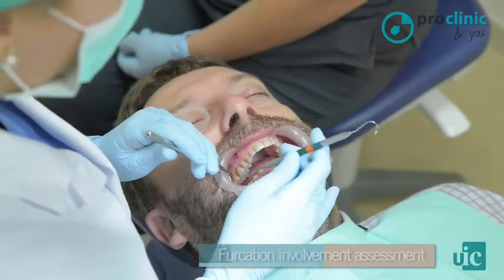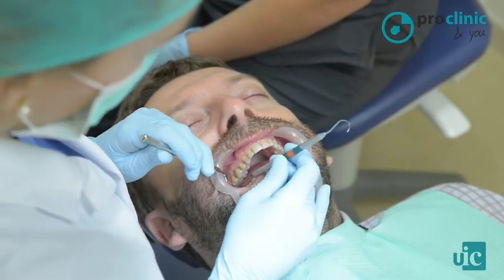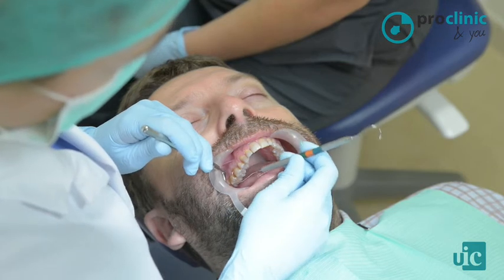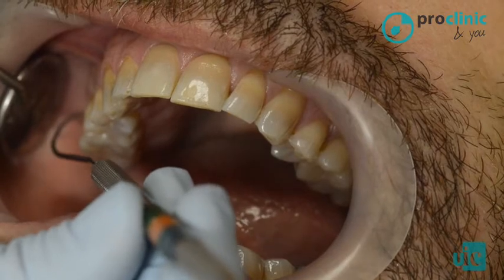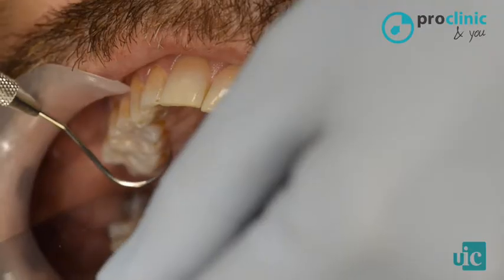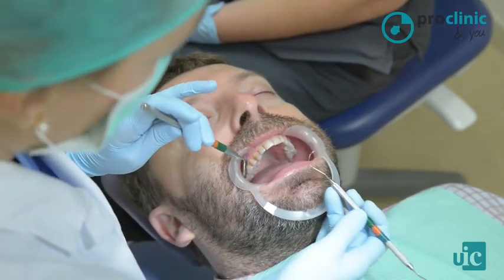To evaluate the furcation involvement, we must first determine how many furcations we have. The upper molars have 3 furcas: buccal, mesial and distal. The buccal must be evaluated from buccal using a Nabers probe, and the mesial and distal furcations from palatal. At the level of the first upper premolar, we can find a mesial and distal furcation.